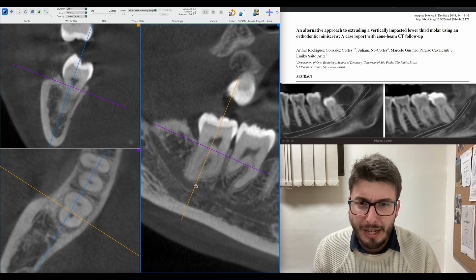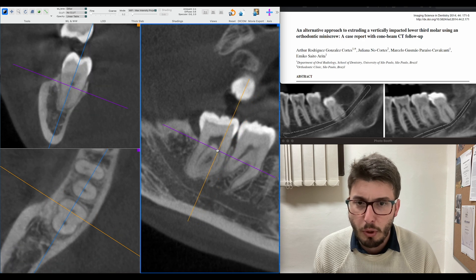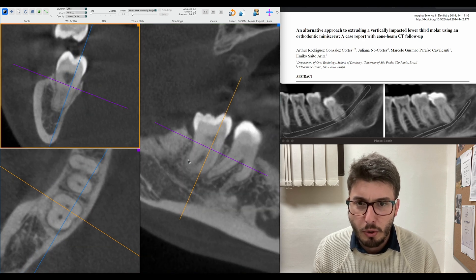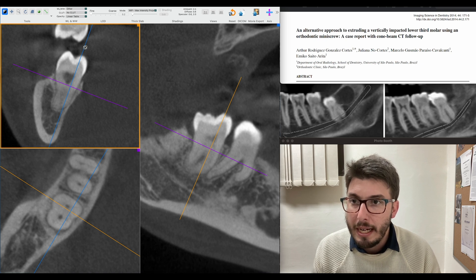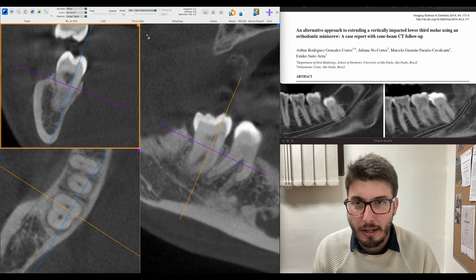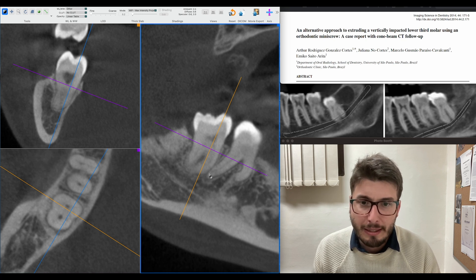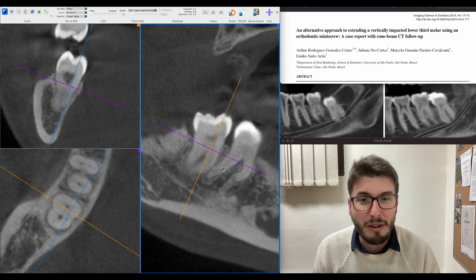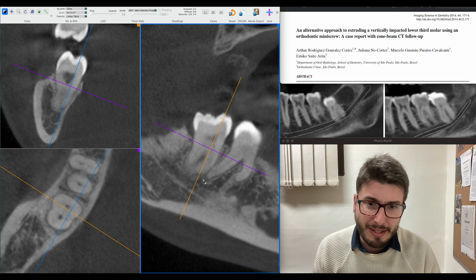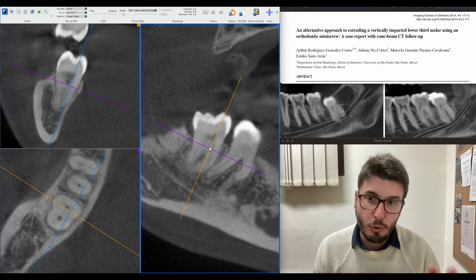Let's also analyze the shape of the submandibular fossa — the concavity is not too deep in this case, so that's acceptable. Moving the axis lingually using the blue line — which takes the picture shown in the blue window — we can see that the distal root of the second molar (tooth 47) is very close to the third molar (tooth 48). There is also widening of the periodontal ligament space at the apex of that distal root, so care is needed during extraction.